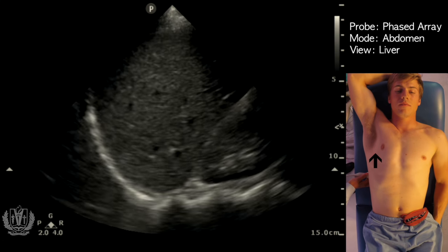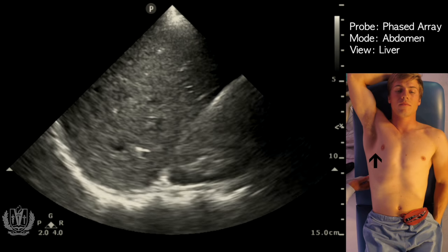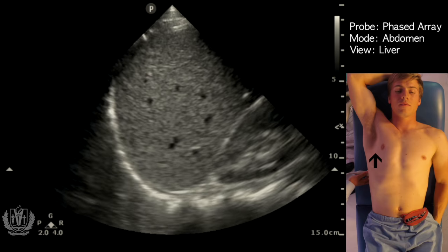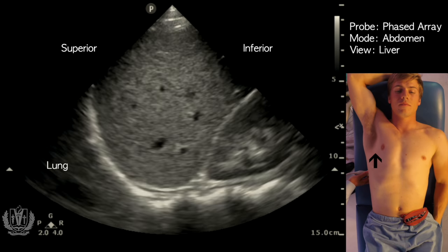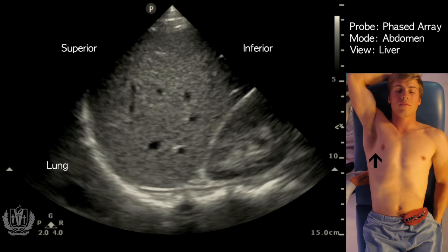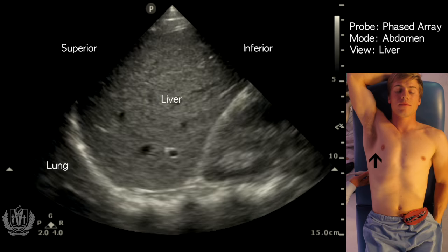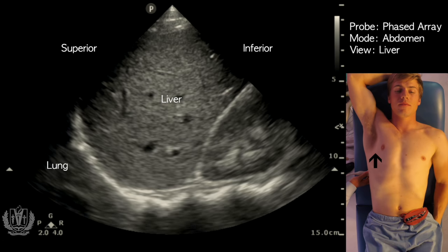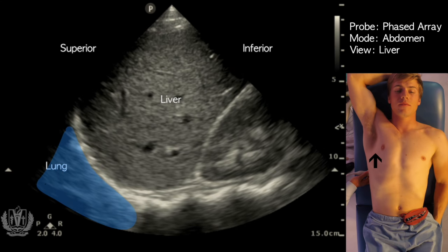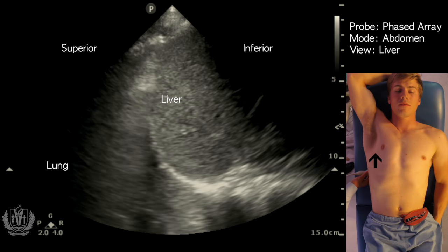Here you can see a nice view of the liver. I'm going to increase the gain. What you want to identify from superior to inferior is the lung as the most superior structure, and what you see there is called a mirror artifact. As sound waves travel through the liver and contact the diaphragm, they reflect back and cause a mirror artifact. This is completely normal because air scatters ultrasound waves, and it looks like you have another liver above the diaphragm.